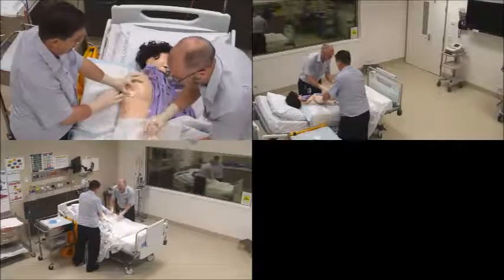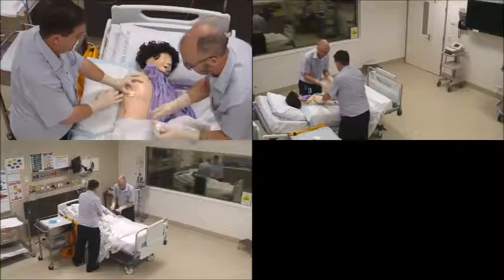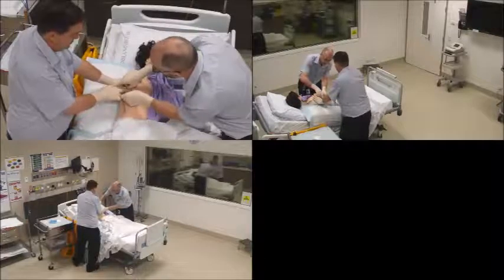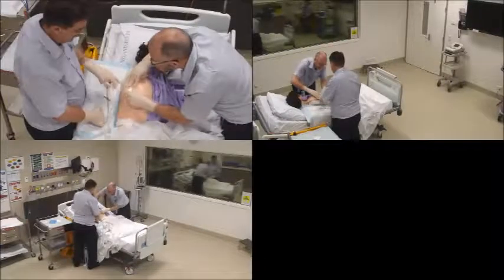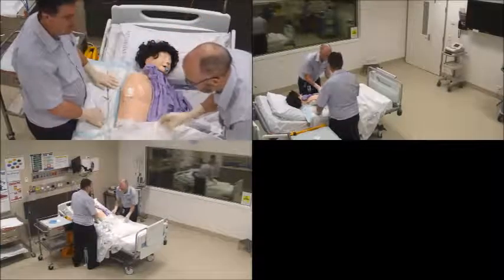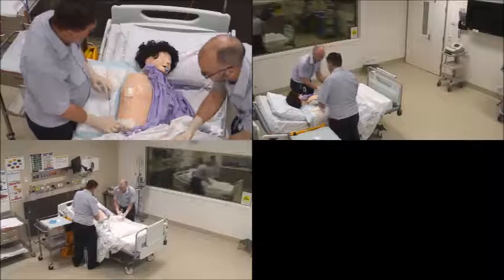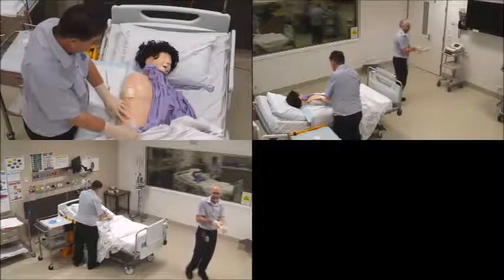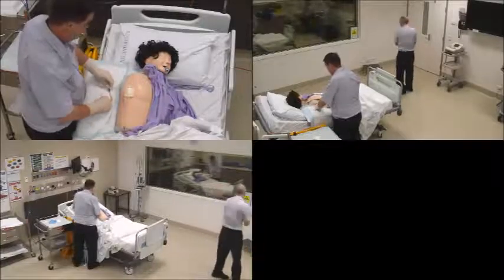Just once more. Got there in hand. Okay. How was that, Scott? That was fine. No problems? Okay. Yes, right.